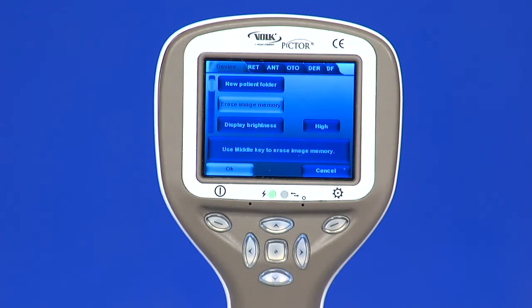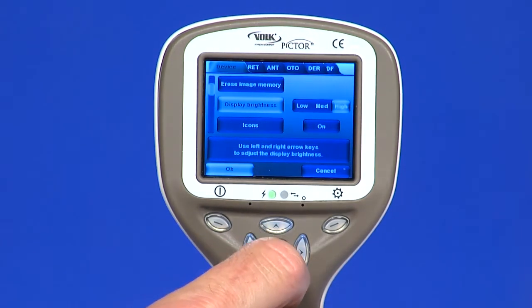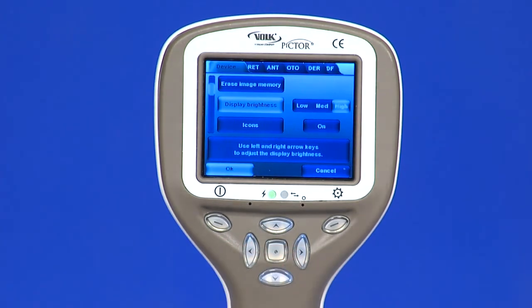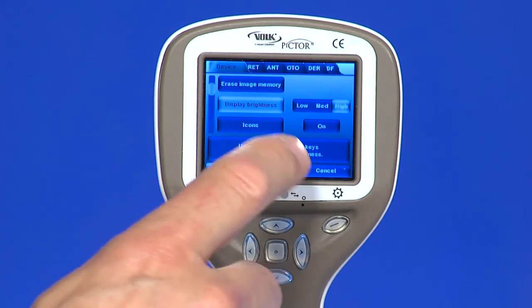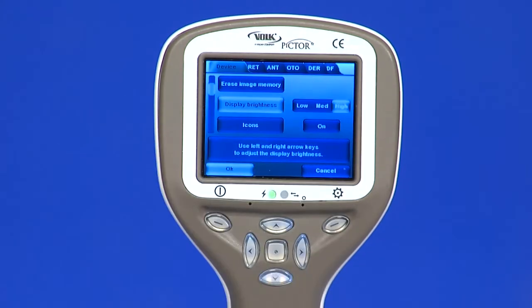Display brightness: the display brightness selection has three options — low, medium, and high. Choose the suitable level of display brightness according to how the examination room is lit up.